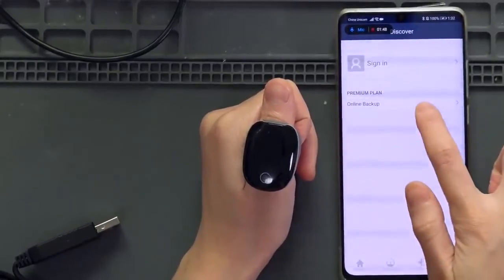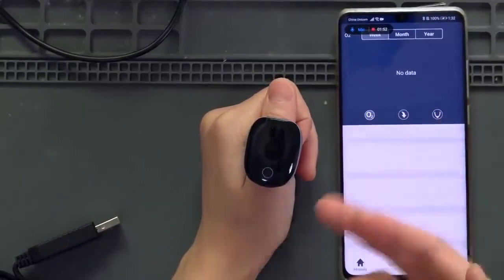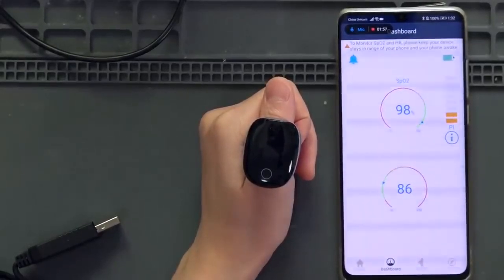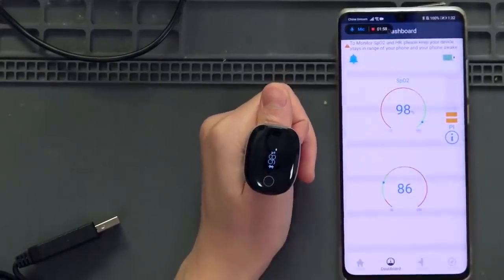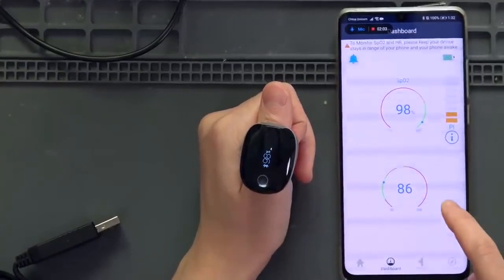On the backup, there is a sign-in option. You can choose to sign in or not, because once you connect to it, it is just Bluetooth. You don't have to sign in with an account — you can, but I am not going to do that. You can see the data on the ring and on the app.